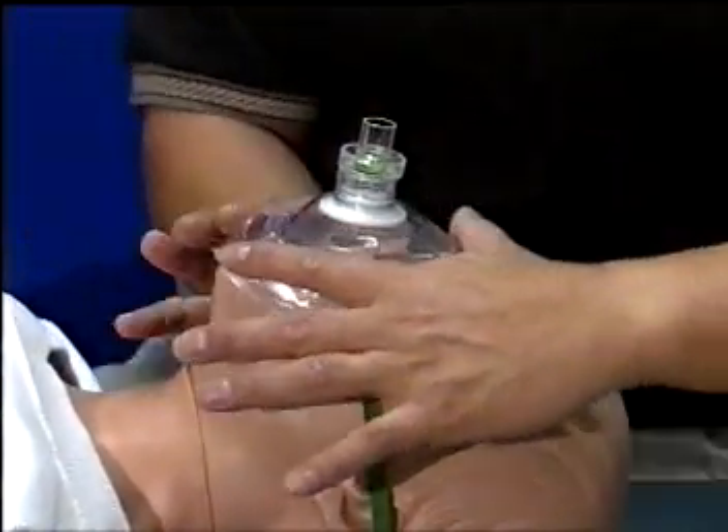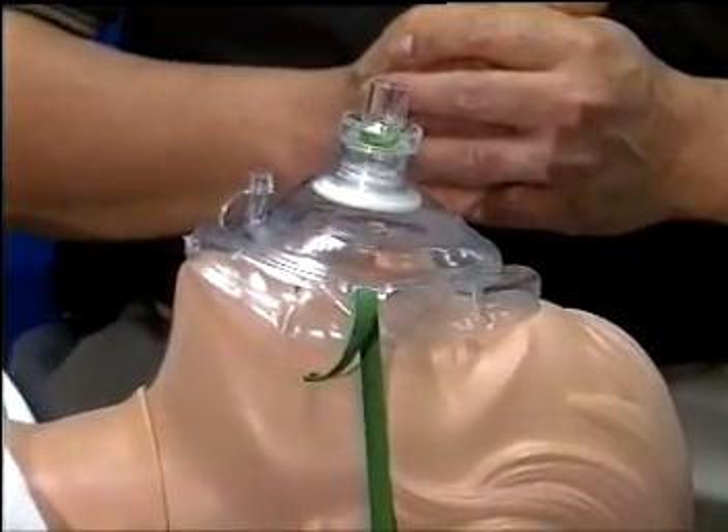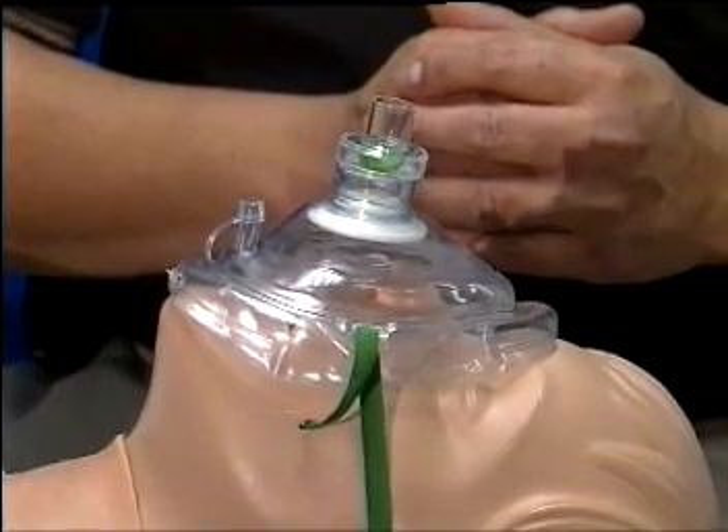The elastic head strap will help to facilitate the mask-to-face seal during CPR when the rescuer has to quickly move from chest compressions to ventilation and back to chest compressions.